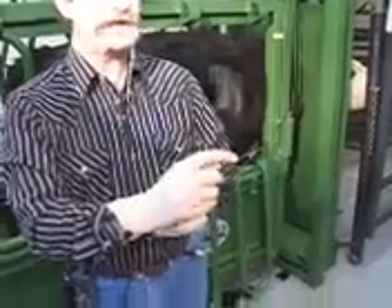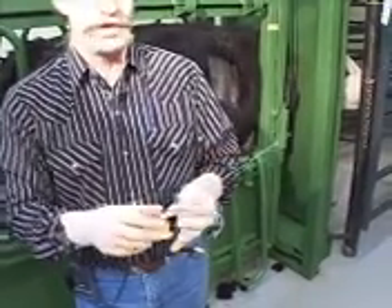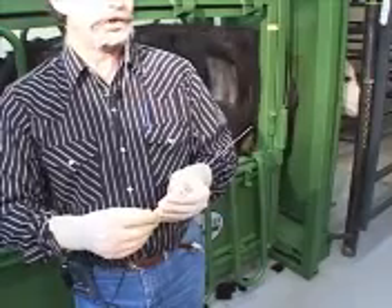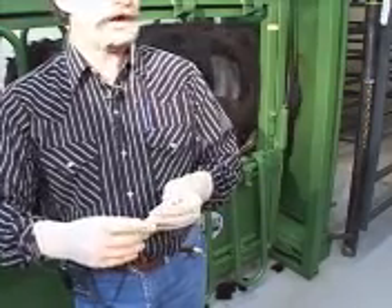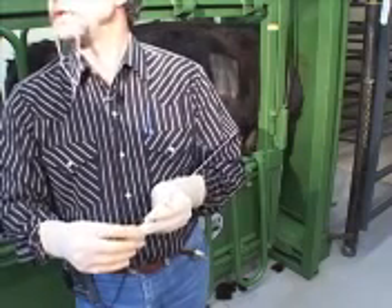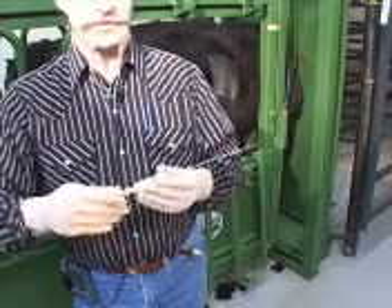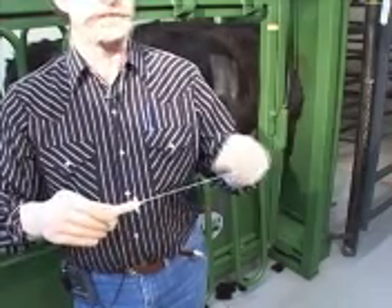The biopsy needle has a notch in it, which is where your biopsy is going to actually come from. When you're going into the animal, you want the stylus slit all the way back. That way you've got a full solid needle pushing through the intercostal muscles and down into the liver. Once you get into the liver, then you push the stylus forward, which opens up your notch.